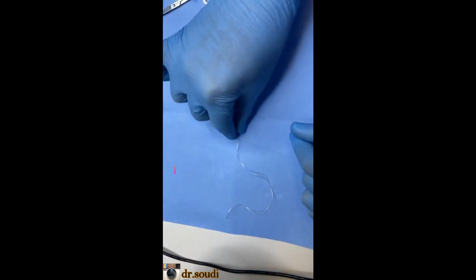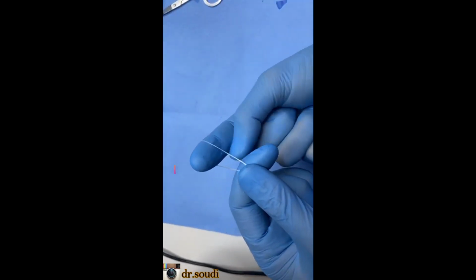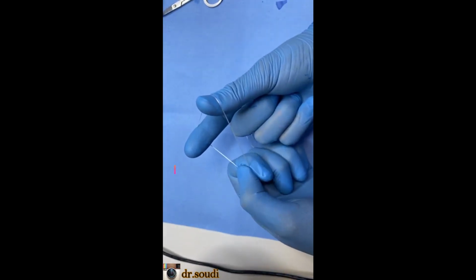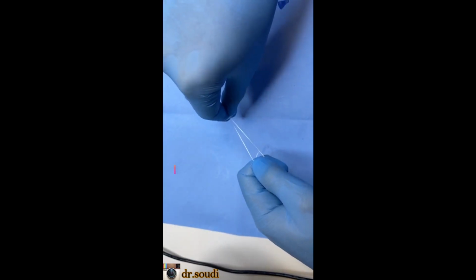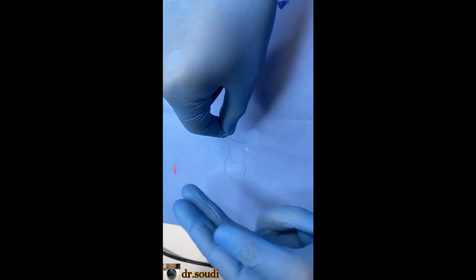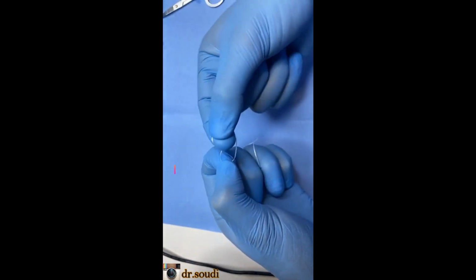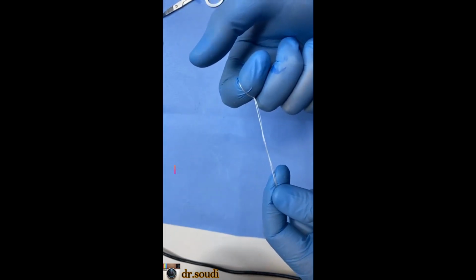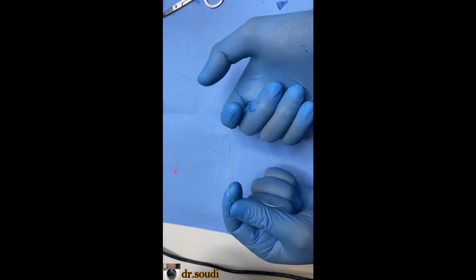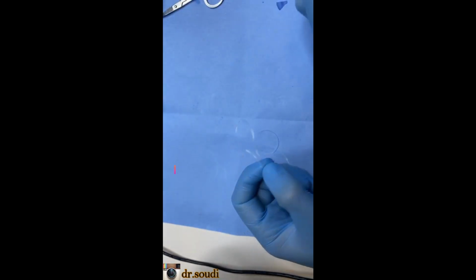Again, I have the dental floss like this. I will get it like this to 2 pieces. Put your 2 fingers here, make it a triangle, then downward like this, and your 2 fingers together like this. Take this part like this part, and from downward to be like this. This is single tie. The single tie mainly I'm not using it because it may loosen when I'm working.